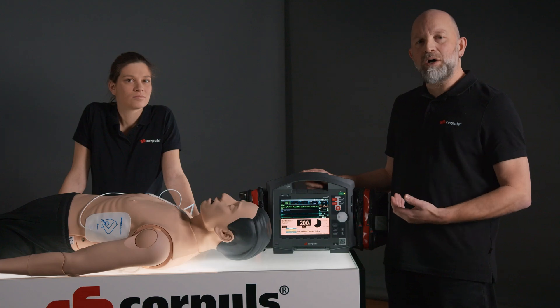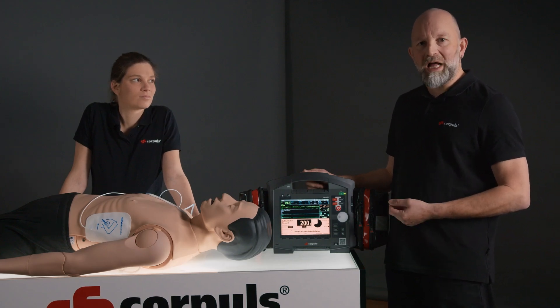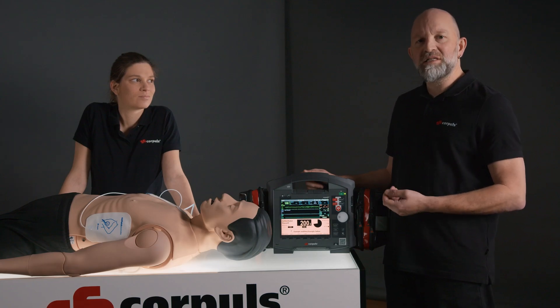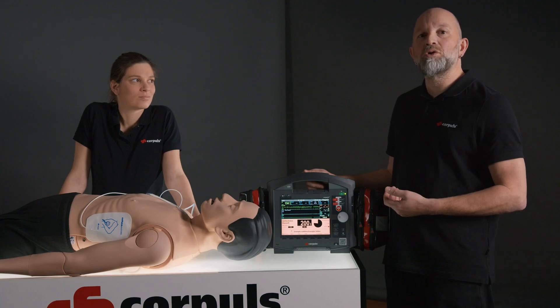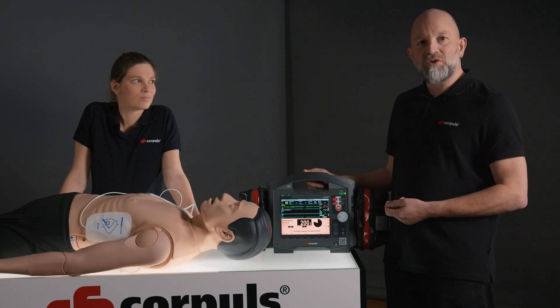The special thing about Auto Sync is that the device tries for one second to deliver a synchronized shock by searching for a QRS complex. If it doesn't find this QRS complex, it automatically delivers an unsynchronized shock after that second. This form of synchronization is only approved for defibrillation.